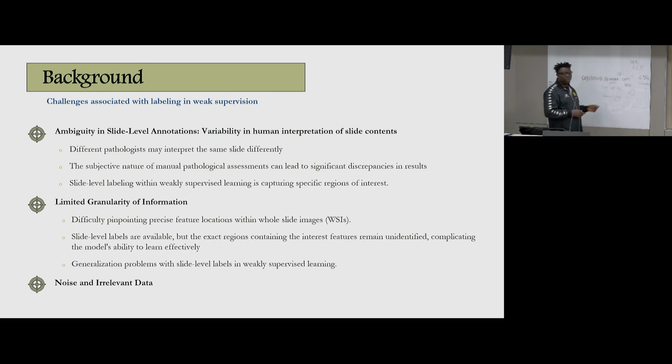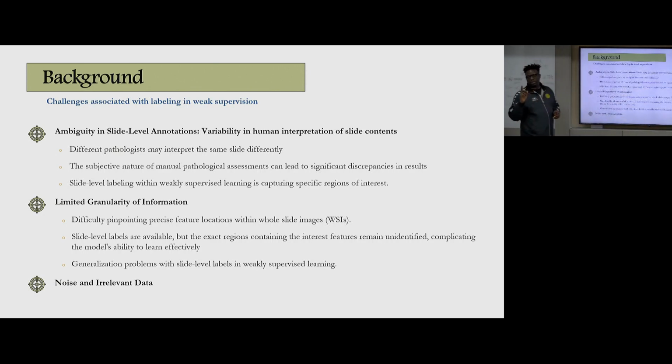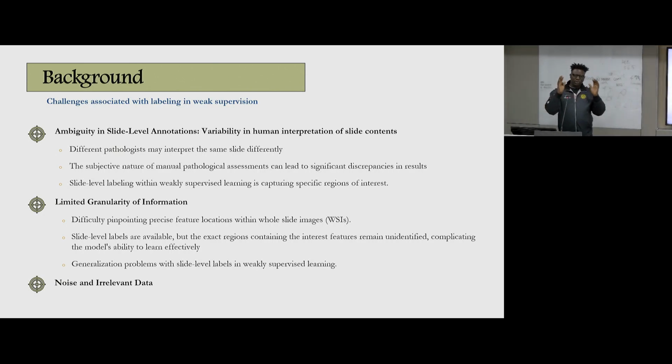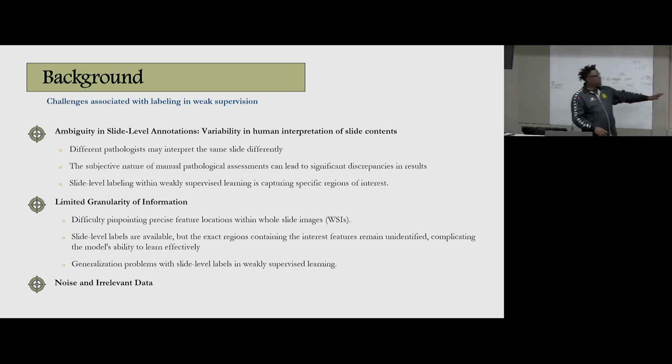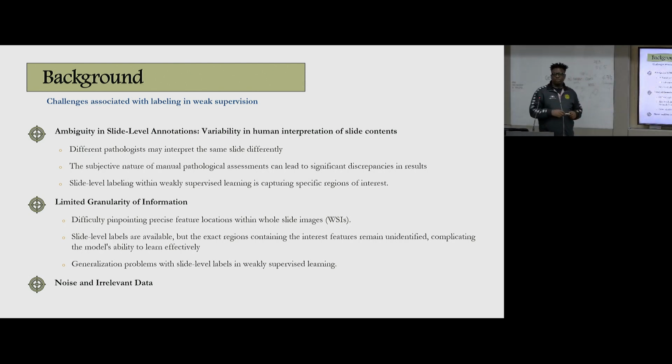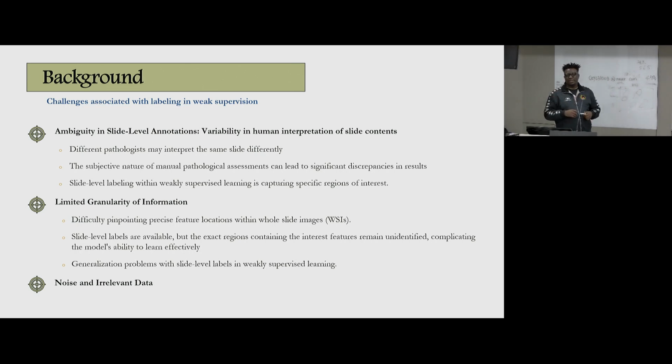That is why we really question how to use whole slide image labels effectively. It's very important. At this point, different pathologists may have different interpretations of one slide. Sometimes they don't understand the thing the same way, or they assess different regions of interest, and then they give various labels. So in most cases, you don't have any ground truth information, like in the case of metastasis.